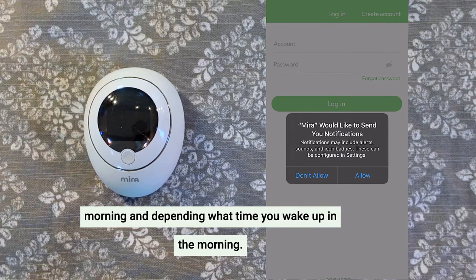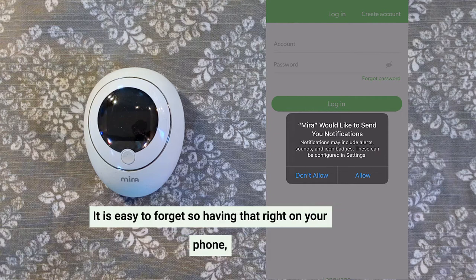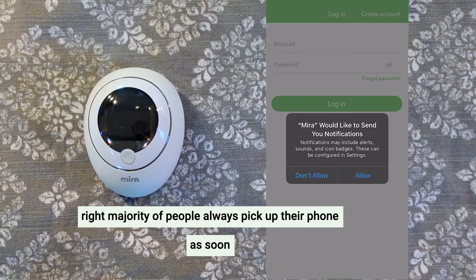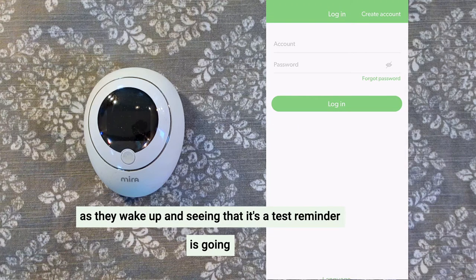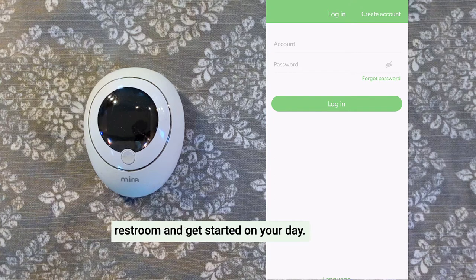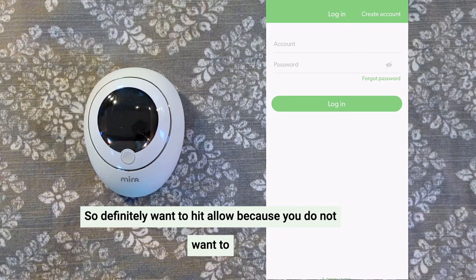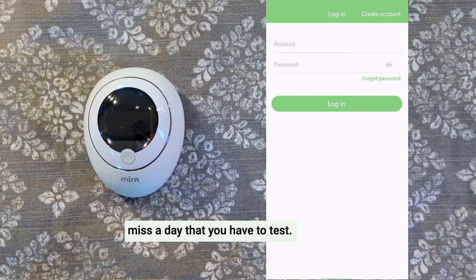This is very important because Mira will send you notifications on when you should test. Depending on what time you wake up in the morning, it is easy to forget. So having that right on your phone — the majority of people always pick up their phone as soon as they wake up — seeing that test reminder will remind you right before you enter your restroom and get started on your day. So definitely hit Allow because you do not want to miss a day that you have to test.